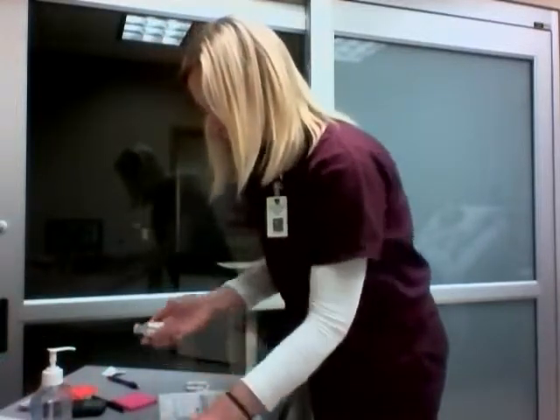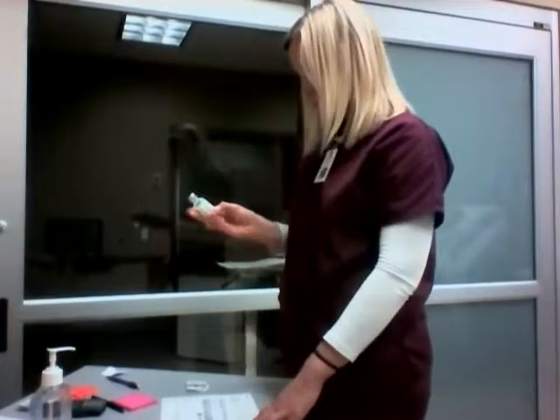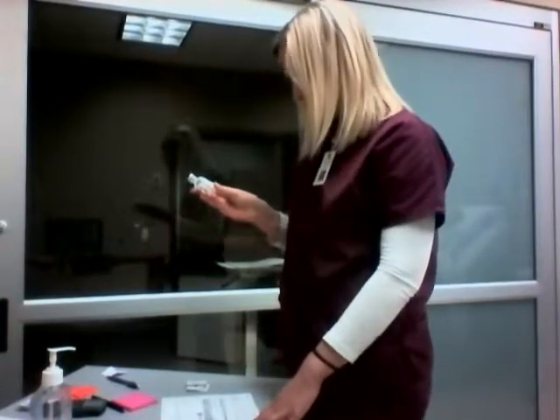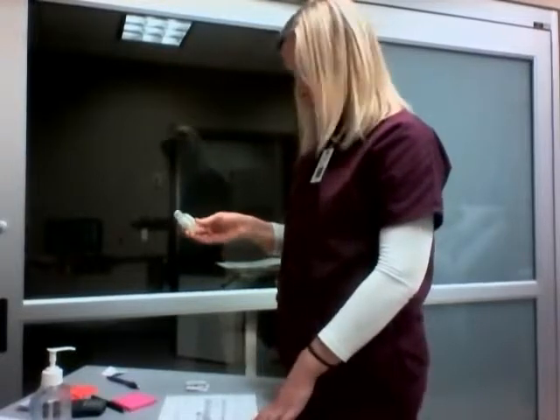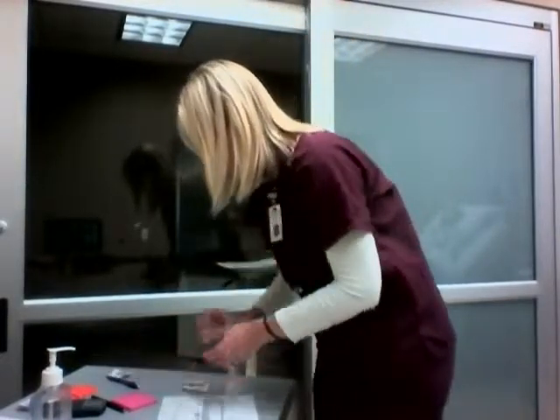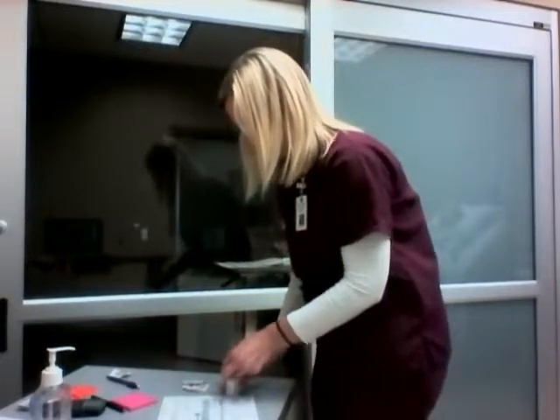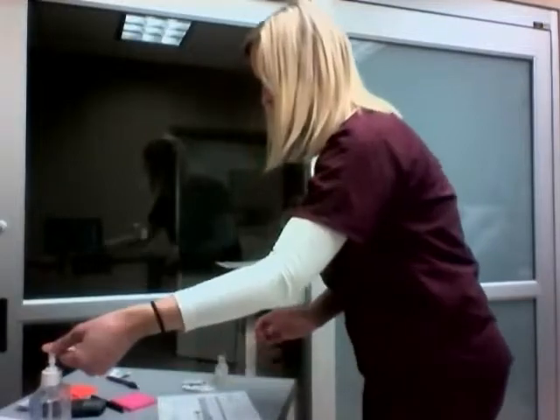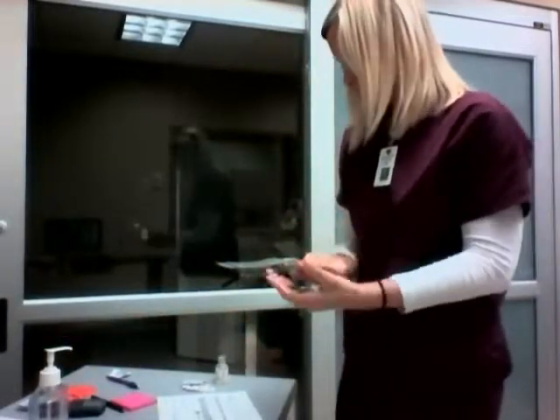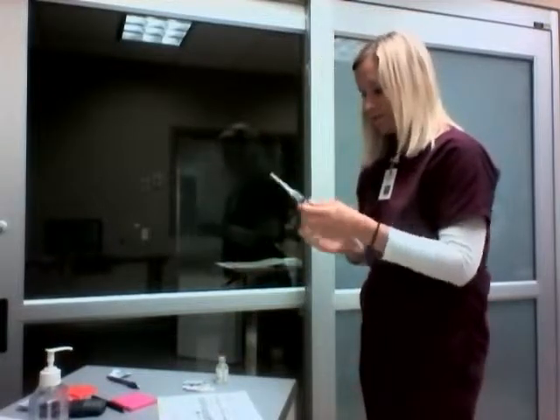So I'm just going to look again at my medication. I have Cardizem 25 milligrams per 5 mils, and this is for IV injection. It's not expired. It is for the correct patient and at the correct time. So I'm going to go ahead and clean my vial. Wash my hands. And now I'm going to draw up 5 mL.